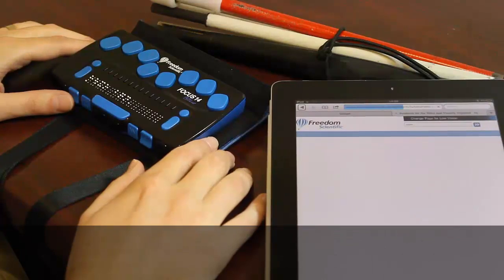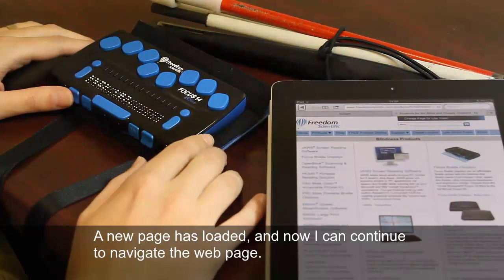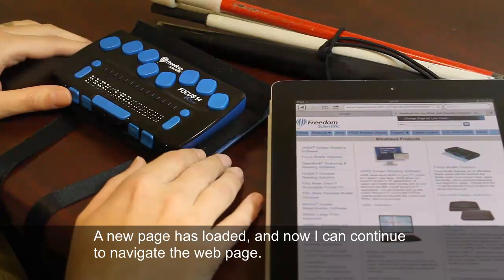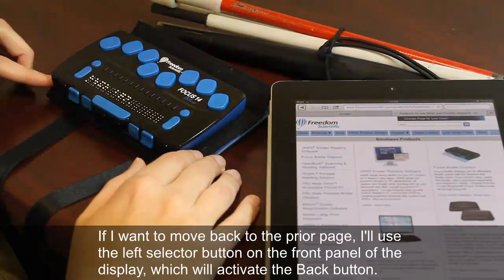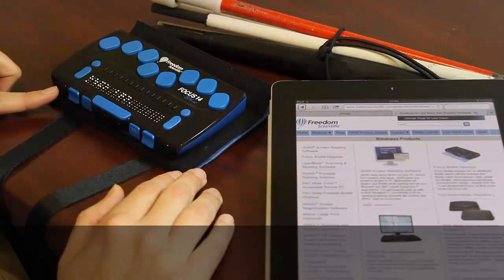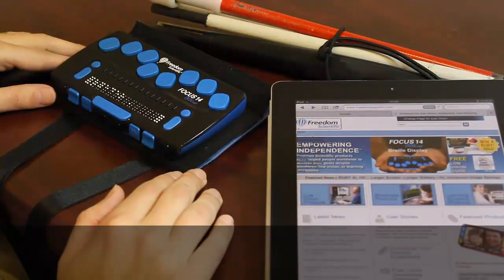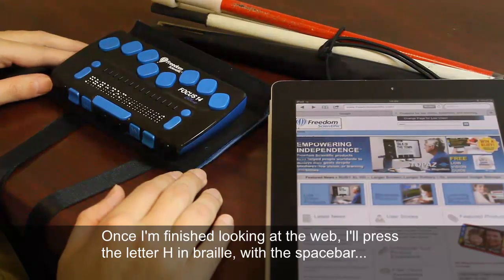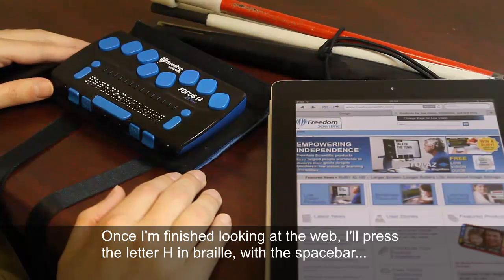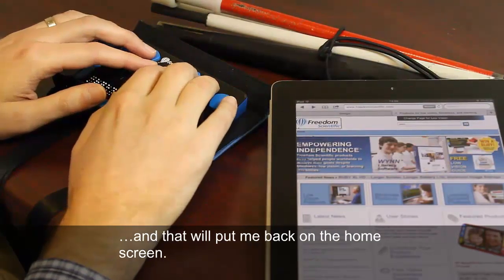A new page has loaded and now I can continue to navigate the web page. If I want to move back to the prior page, I'll use the left selector button on the front panel of the display, which will activate the back button. Once I'm finished looking at the web, I'll press the letter H in Braille with the spacebar — also called the H chord — and that will put me back on the home screen.